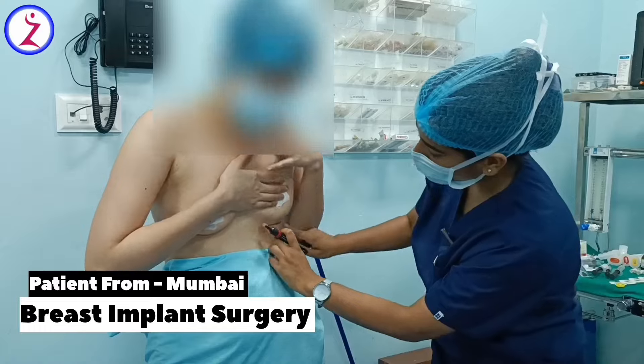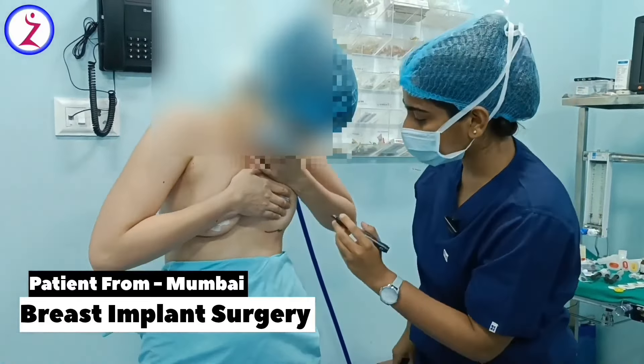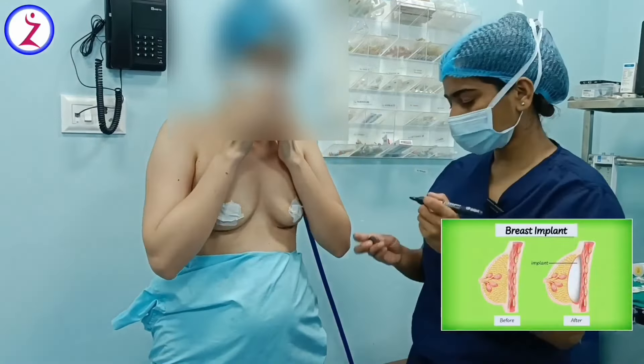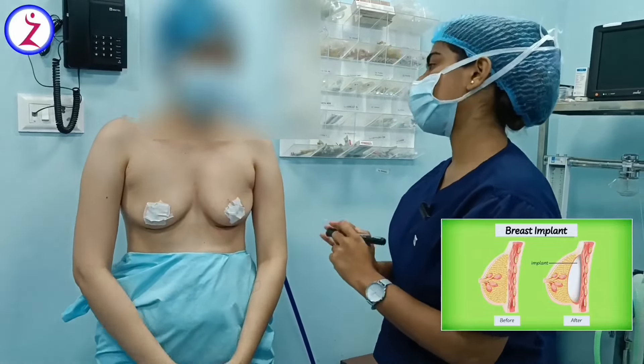In this case, we have placed a marking where we place the breast implant. Under the breast, we place the marking, which we call the inframammary fold. We place the breast implant here at the time of surgery.